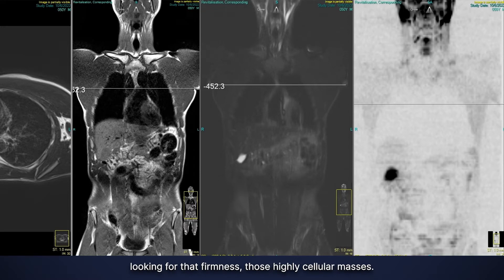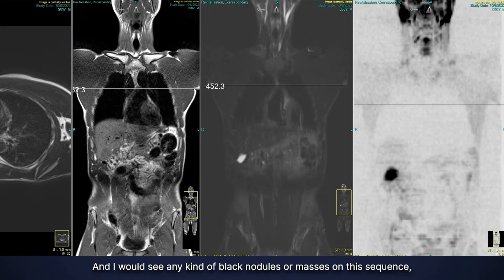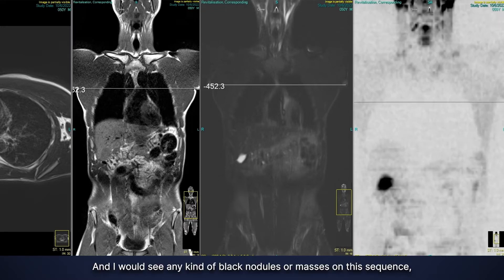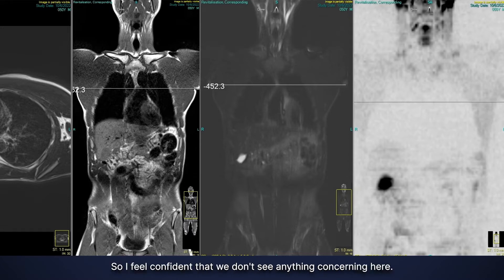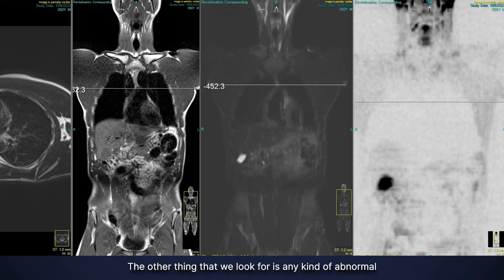I would see any kind of black nodules or masses on this diffusion sequence, and I don't see anything there. So I feel confident that we don't see anything concerning here.